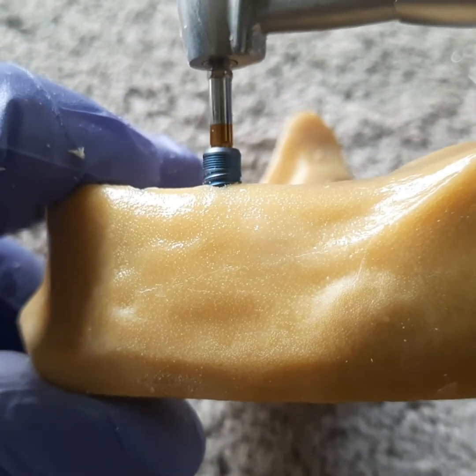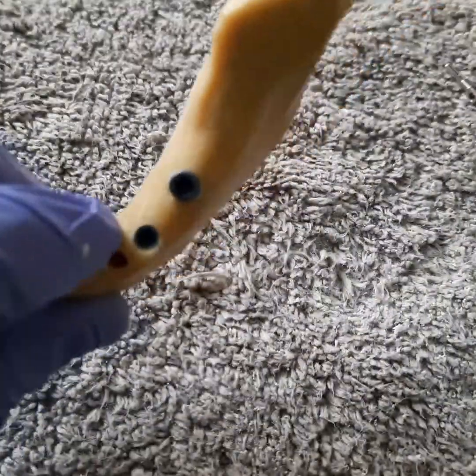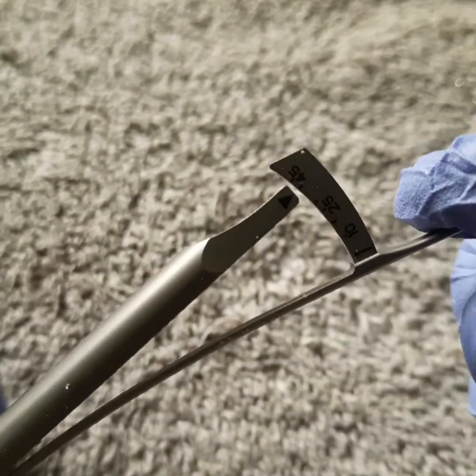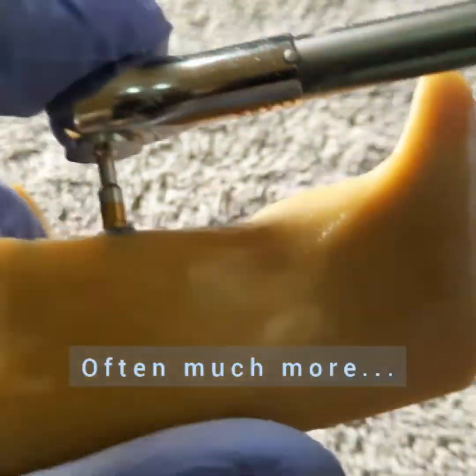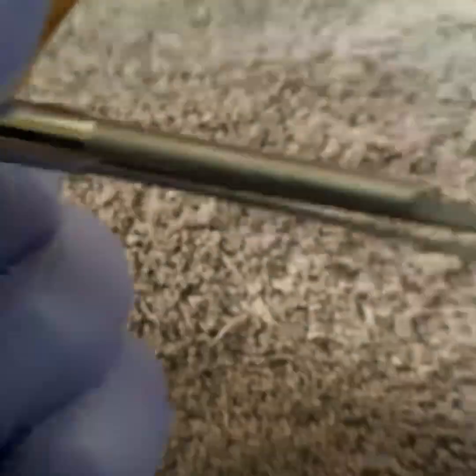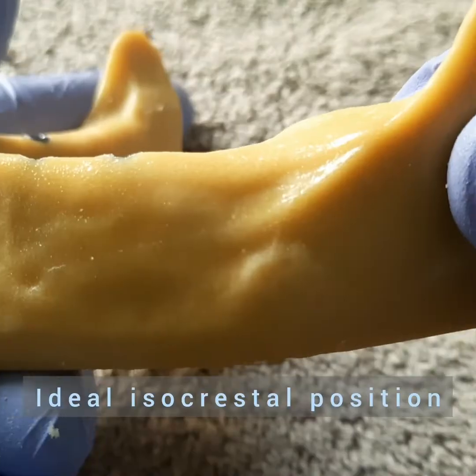The fixtures themselves can be machine or hand-driven to high torque values while achieving good primary stability. The recommendations for immediate loading are from 30 to 45 N-centimetres. The company recommends an isocrestal position, which means that your implant shoulder should be at the level of the bone crest.